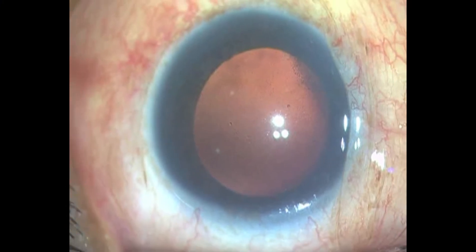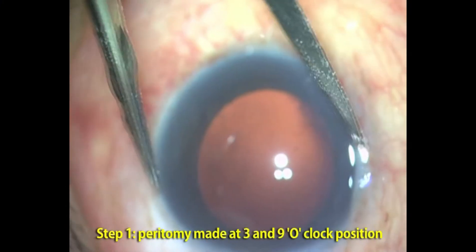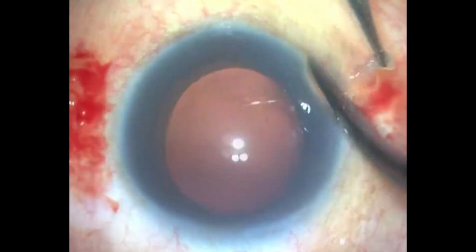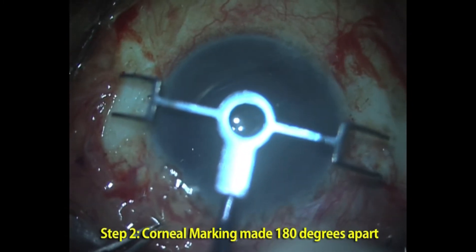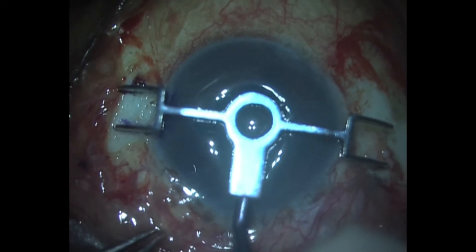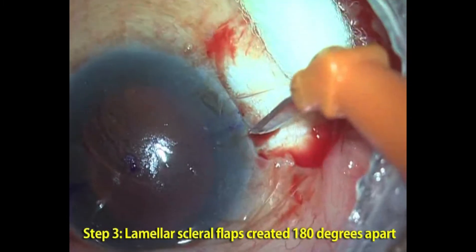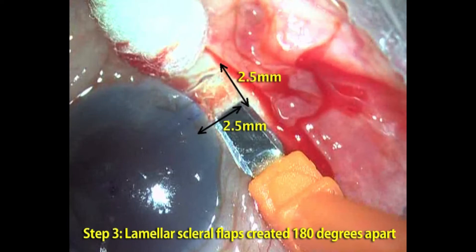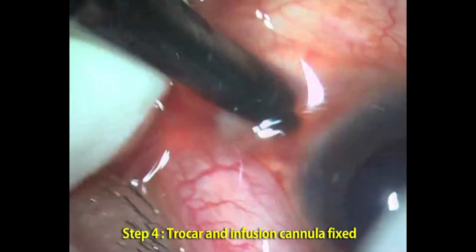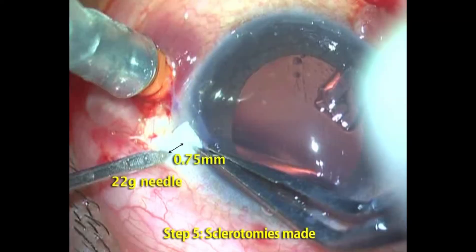In glued intrascleral IOL surgery, a caliper is set to 11 millimeters to measure the corneal diameter from white to white. Scleral flaps have to be created 180 degrees apart using a flap marker. Partial thickness scleral flaps are created 180 degrees apart. Infusion can be either behind the limbus or in the anterior chamber beneath the scleral flaps.